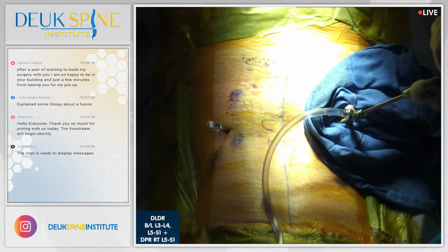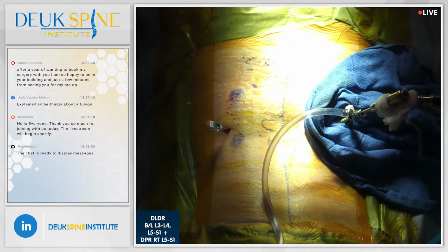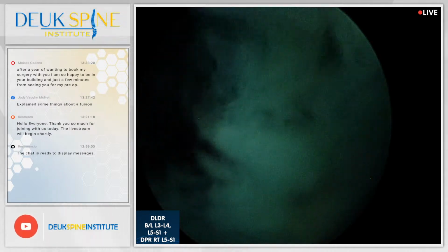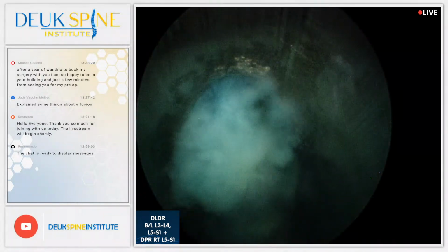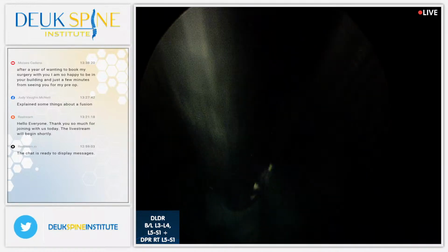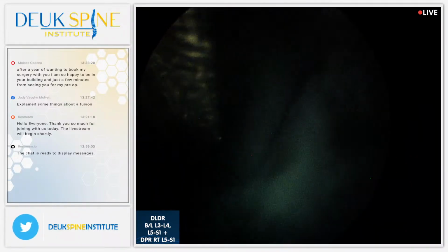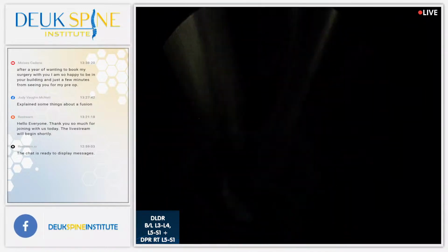At this moment, no current questions. So folks, we're starting here at L3-4, and we're going to show you why is it that discs, remember the video showed you 30 causes of back pain, but we didn't talk about how the discs cause back pain. So Henry, let's show the audience how do injured discs cause so much back pain for patients.